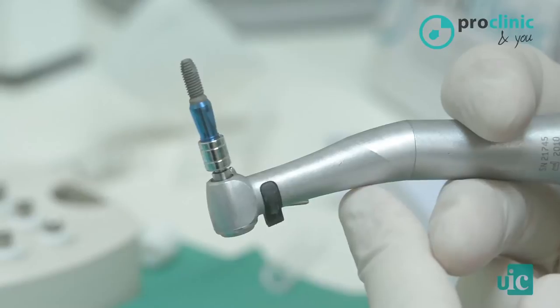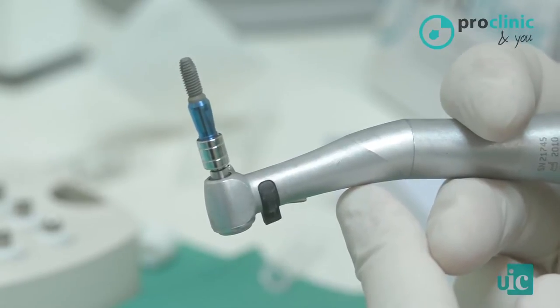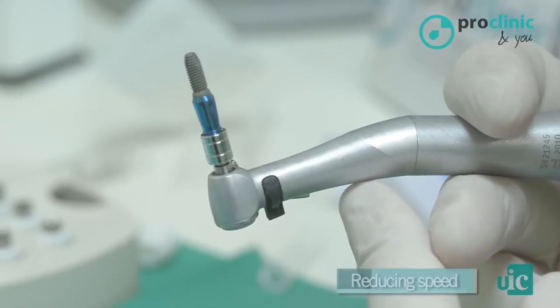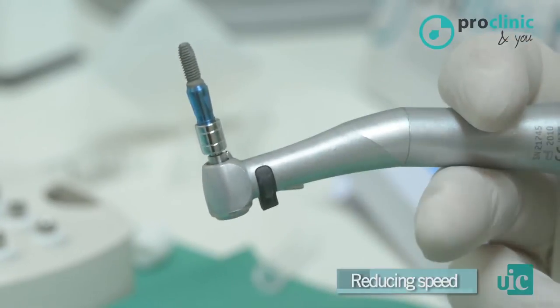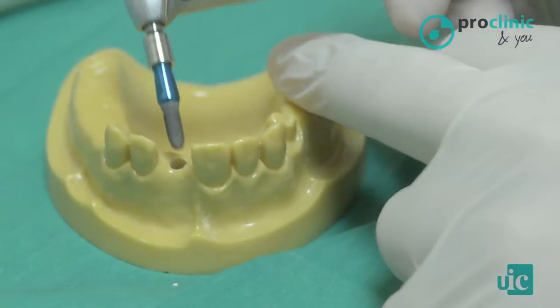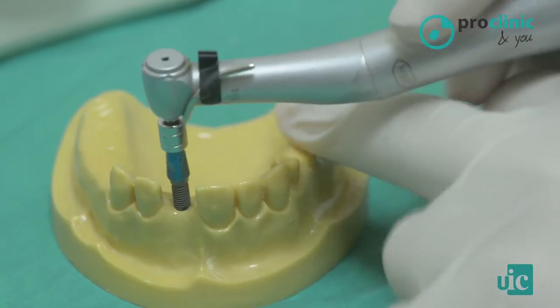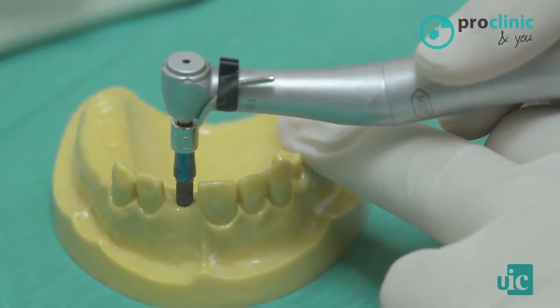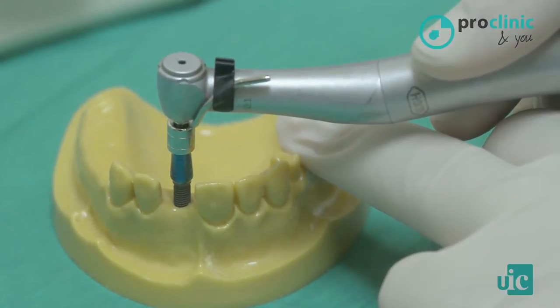Previously, we must reduce the speed of the surgical motor to place it slower, to control the insertion torque. We insert the implant into its bed, always trying to control the parallelism.